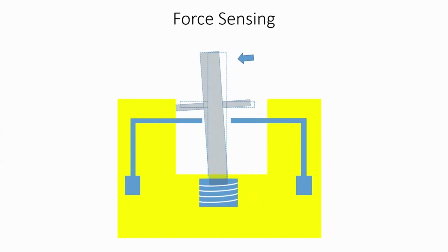If the force is in this particular direction, which is shown here, again you will see the change in the spacing between the electrodes, and you can see the change in the capacitance. But this is only one way. There can be a capacitive force sensor, a piezoresistive force sensor, a cantilever, there can be strain gauges. There are unlimited designs for force sensing.